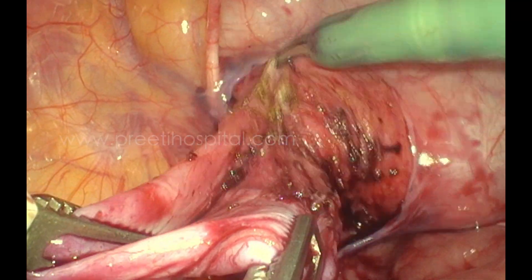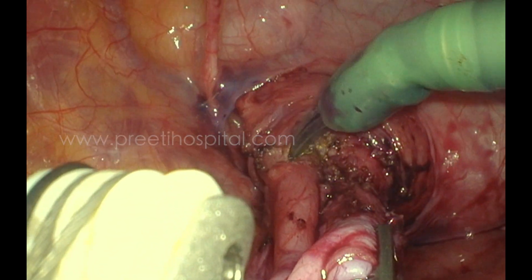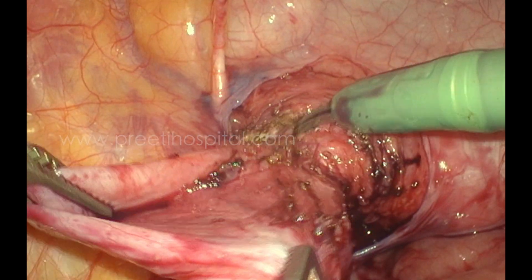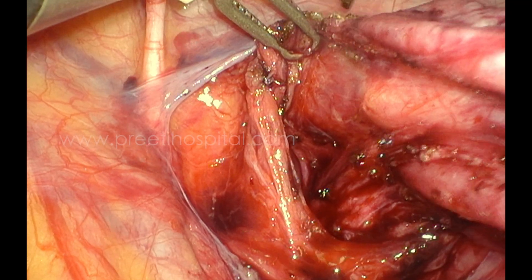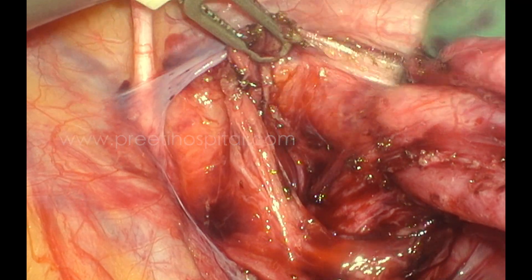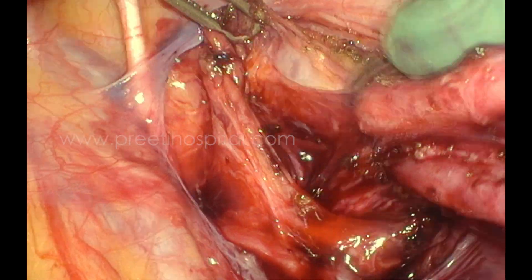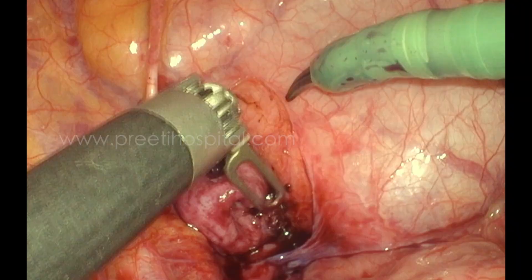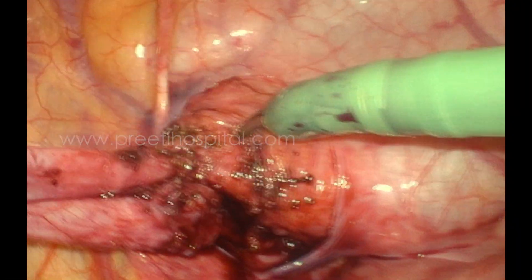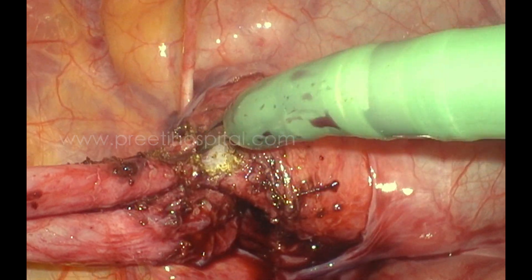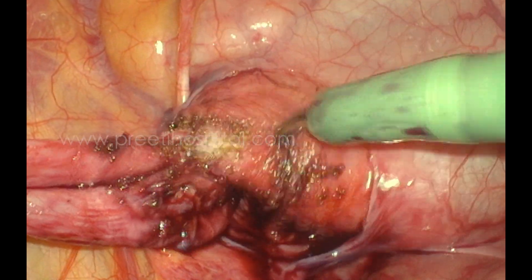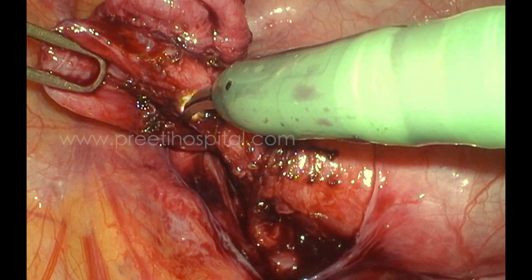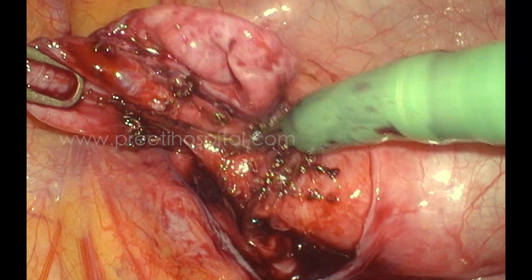Once we confirmed and reconfirmed that the ureteroscope entry corresponds to the same site, we focused on the posterior-lateral aspect on the left side. We meticulously dissected up to the detrusor, and at the end we could see that we were separating the detrusor as well.